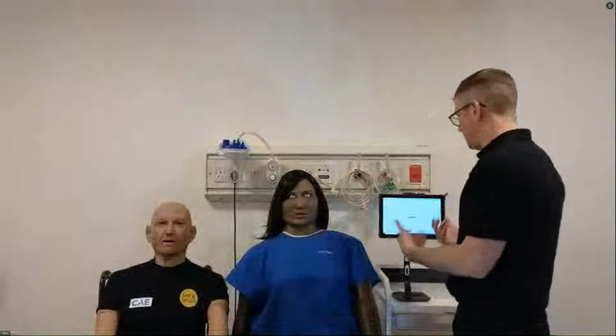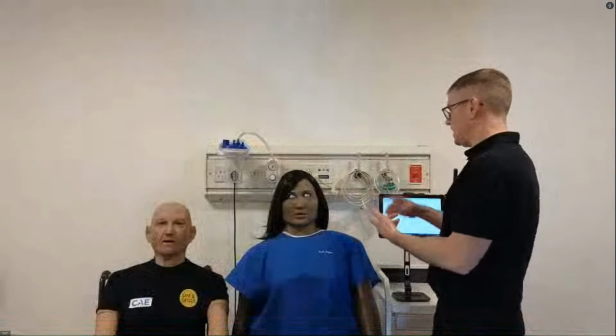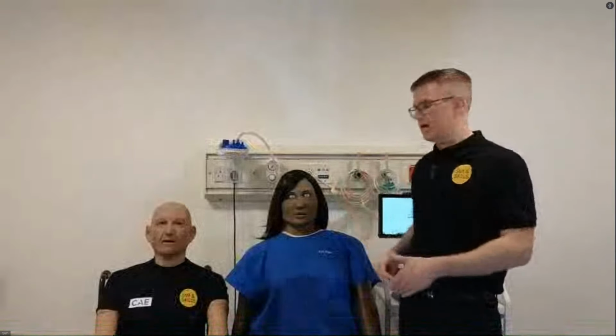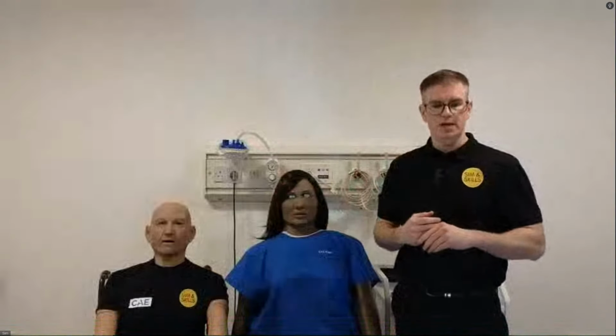If I was to stand beside Aries now, I could look at any notes that have been taken, any ward round notes, any history of bloods, drugs, etc. And if I wanted to request something like an X-ray, I would do it on the EPR system, and the person in the control room on the tablet would receive that request and then could send it back and forth. So it's a live system.